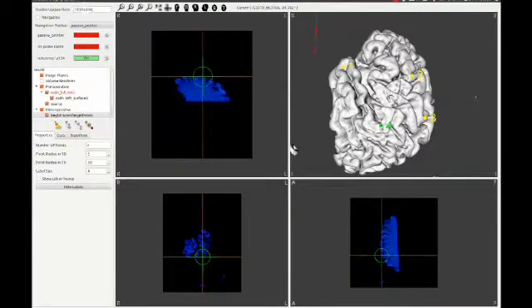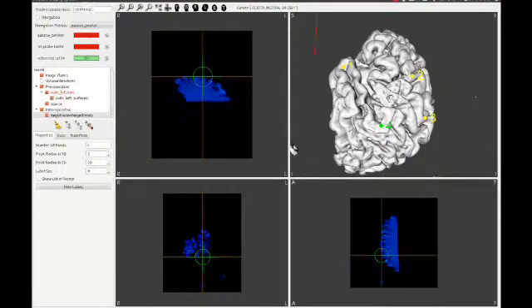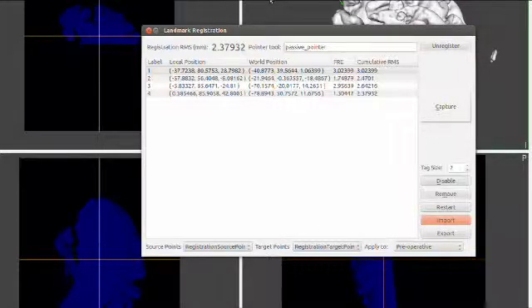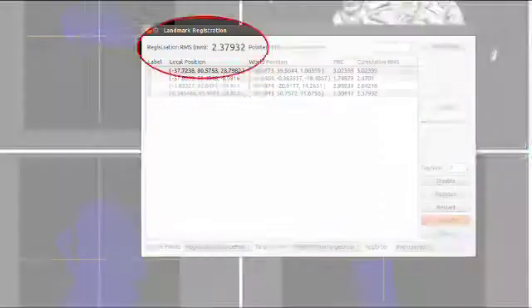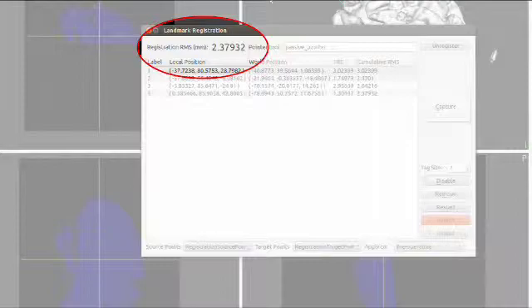In this demo, we have only chosen four points on our phantom and on the preoperative images. Once the patient image registration is complete, IBIS will report the fiducial registration error as the root-mean-square distance of the chosen fiducial point pairs.